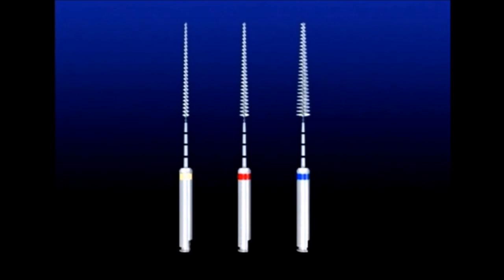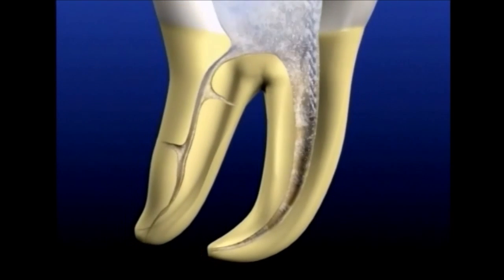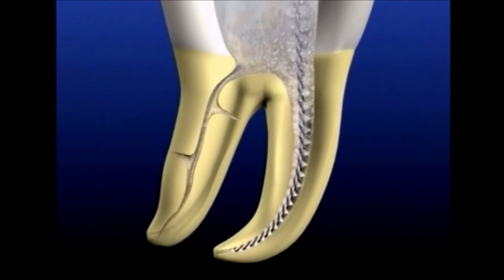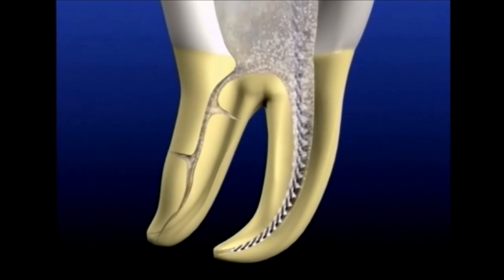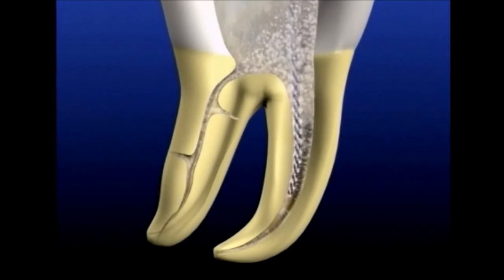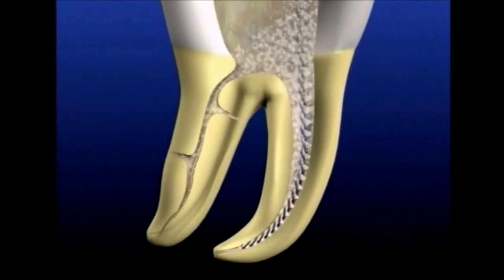Currently, I'm using microbrushes to optimally finish the root canal preparation. Microbrushes can be selected, activated, and used in a rotary handpiece. A high magnification demonstrates how the bristles are attached and shows the helical angle that augers debris out of the canal. Finishing an irrigant-filled shaped canal with a microbrush has been shown to significantly enhance the cleanliness of the preparation. Tapered microbrushes enhance cleaning as bristles deform into the irregularities of the preparation and move debris into solution where it can be liberated from the root canal space.